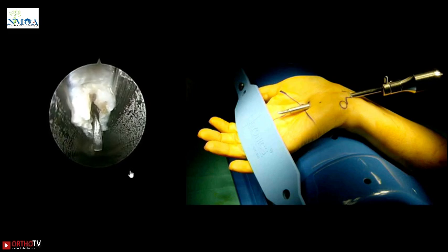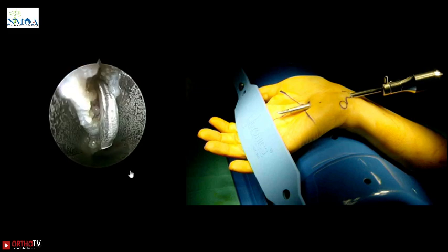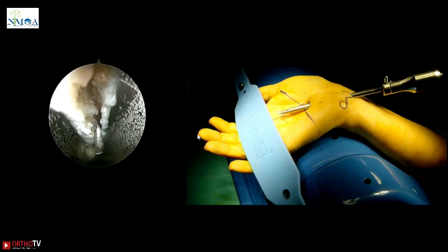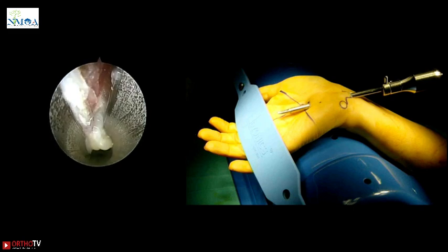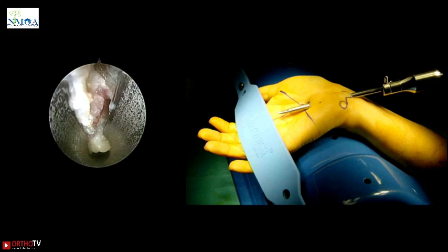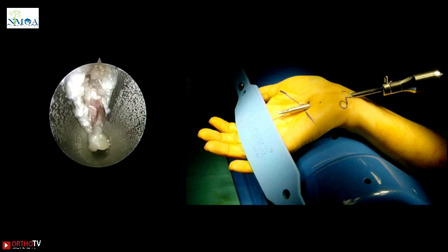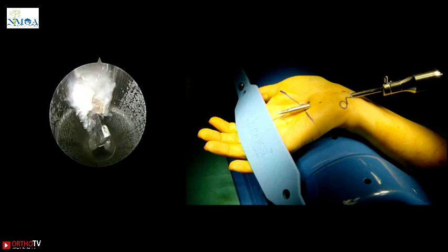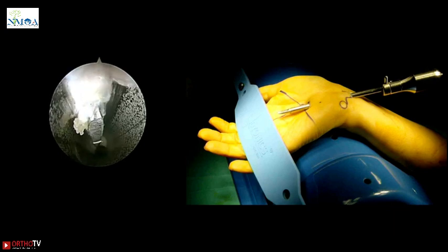It's cutting the carpal tunnel, now the carpal ligament. Now the scope is from the patient's proximal end, and the cutting instrument is going from the distal end. The reverse cutting knife is cutting, then you can see the muscles or band above the cut carpal tunnel ligament. Now there is a third knife available that protects the superior surface but cuts on the front. As we advance ahead, it keeps on cutting the carpal ligament.